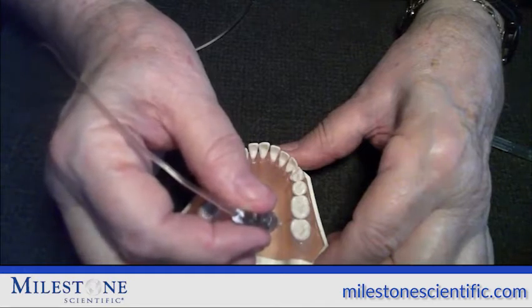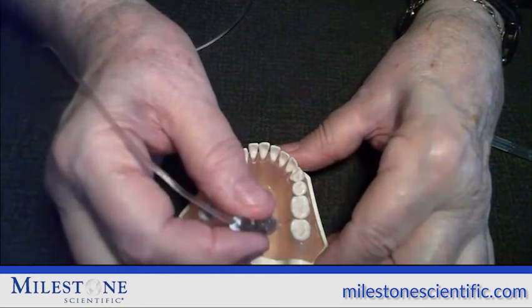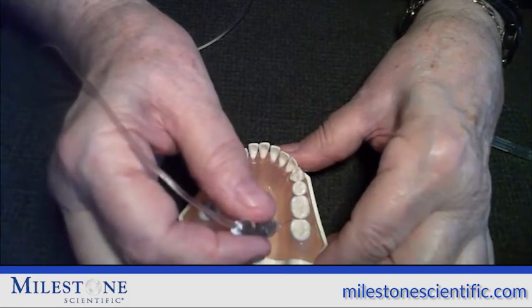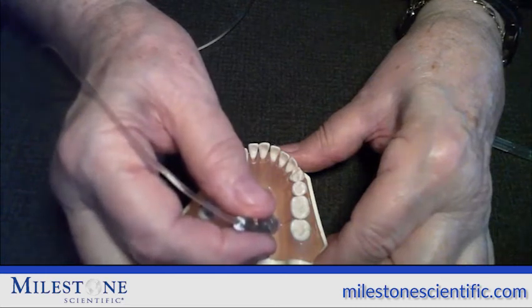reach resistance. Then after 10 seconds or more, you're going to hear the lights and sounds of the DPS come on. Hold the needle lightly. Do not put pressure on the needle, trying to make the lights go past yellow or red. Do not put pressure on the needle to let the lights go all the way to green. That's probably going to be blocking the flow of the anesthetic so it does not drip into the bone.